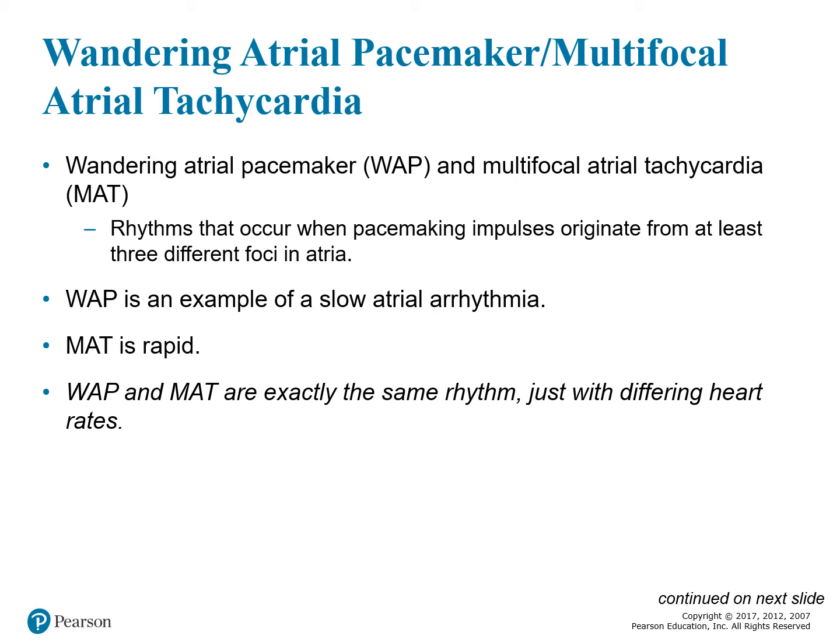It's just an updated term for a wandering atrial pacemaker. In this rhythm, the size, shape, and direction of the P waves vary, sometimes from beat to beat. The difference in appearance of the P waves is a result of the gradual shifting of the dominant pacemaker among the SA node, the atria, and the AV junction.